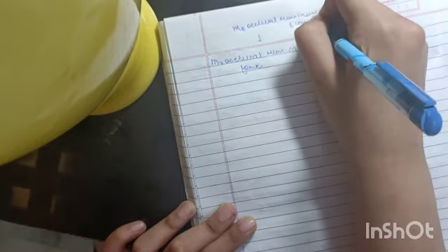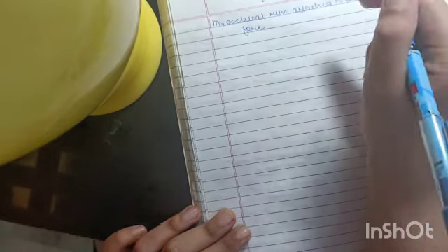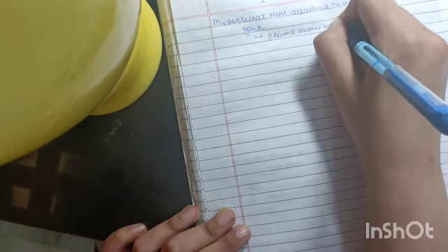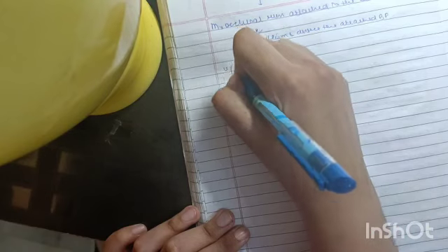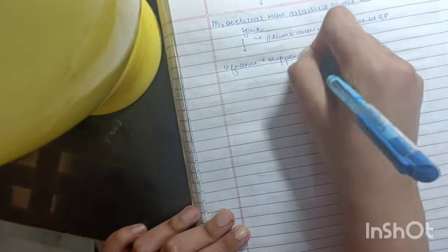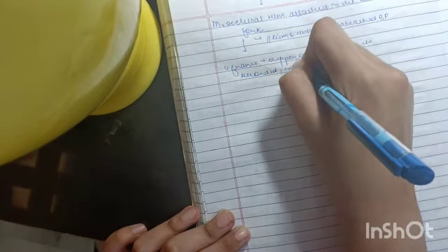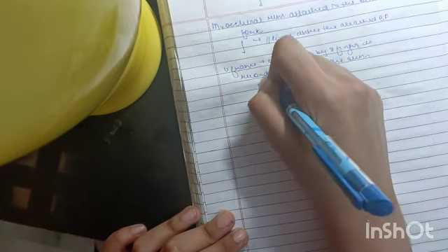After attaching the maxillary occlusal rim and the bite fork, we will achieve parallelism and we will center the attached bite fork. After this, the U frame, supported by two fingers, is inserted to the stem of the bite fork.